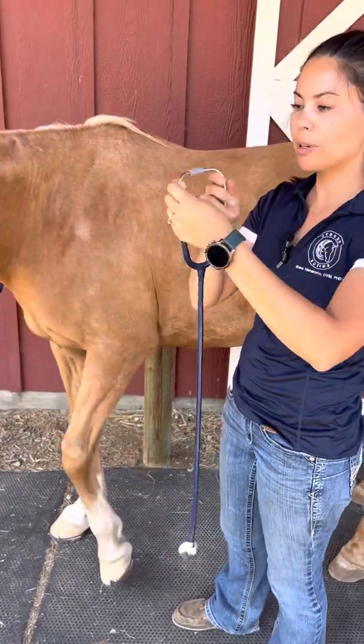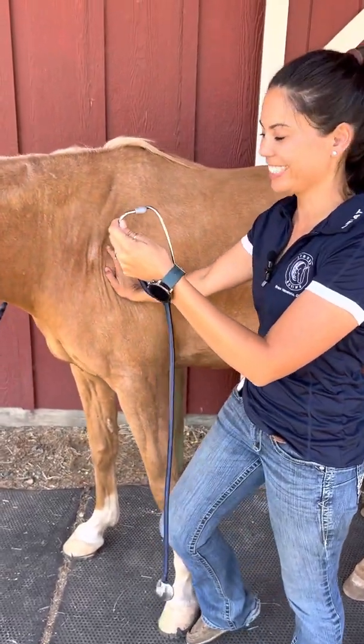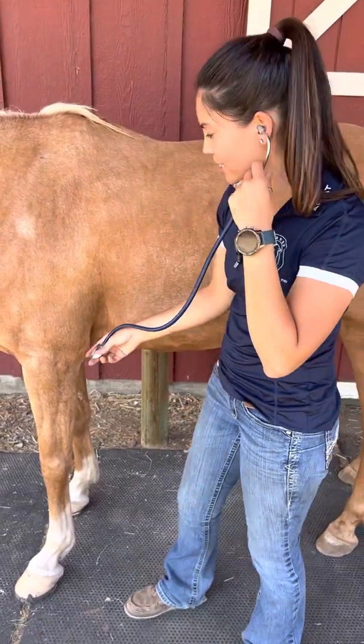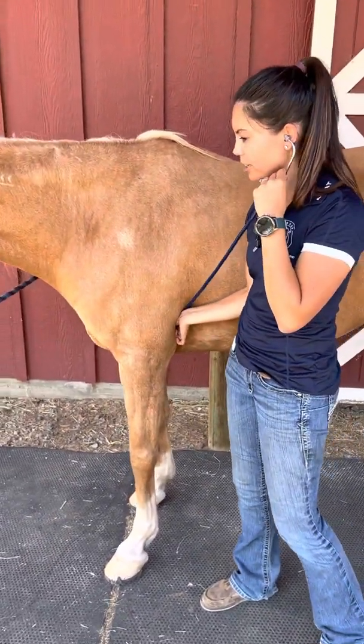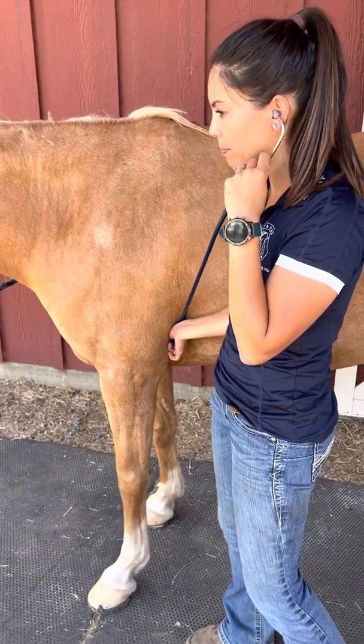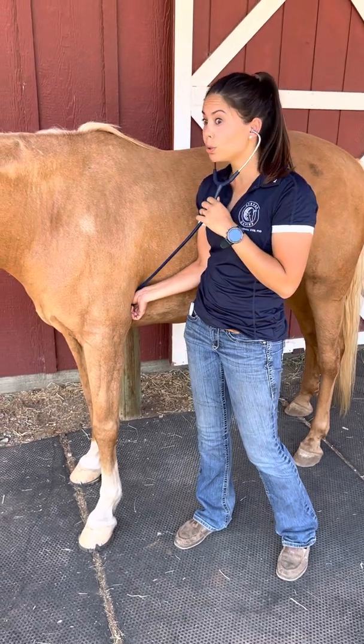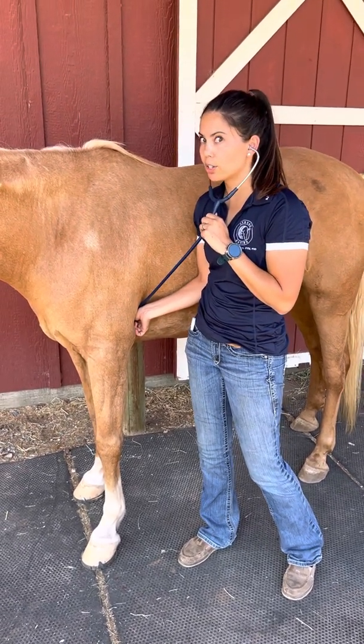So again, put your stethoscope in. Always have your ears pointing out. And then take your stethoscope and put it right there. And you should hear it go lub-dub, lub-dub, lub-dub. If you hear any swooshing or anything like that, definitely let us know.